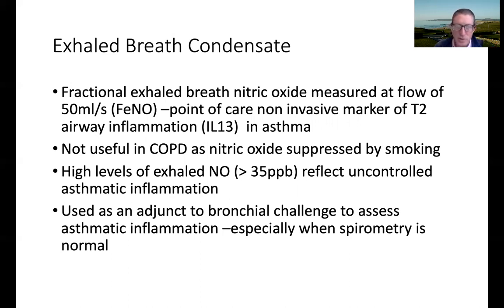Have they got asthma, yes or no? And if it's equivocal, you do a bronchial challenge test with an exhaled breath nitric oxide, particularly in patients who've got normal spirometry. So what happens is that if you've got twitchy airways, that will usually be accompanied by a raised level of exhaled breath nitric oxide. Now, I'm not going to be doing challenge testing routinely in the clinic. It takes too long, but a FeNO test takes like 2 or 3 minutes. Spirometry takes about 5 minutes, impulse oscillometry, a couple of minutes.